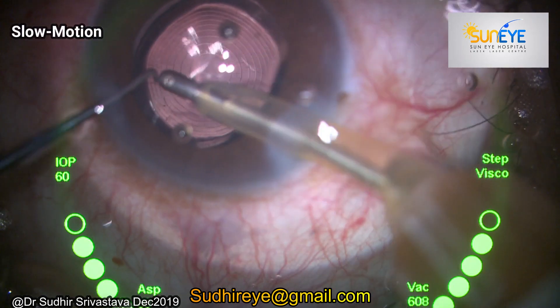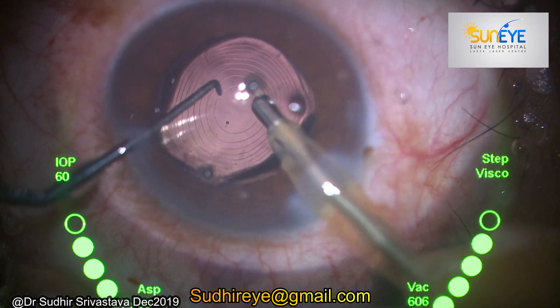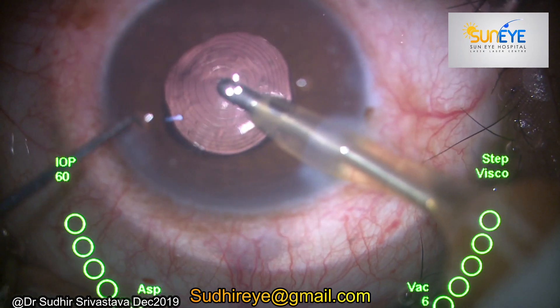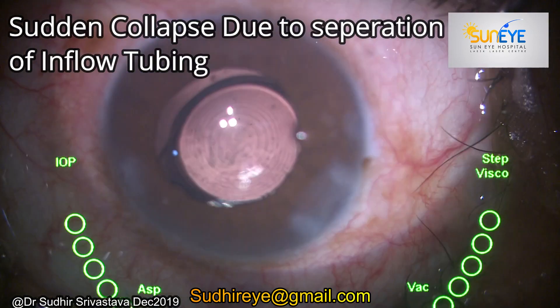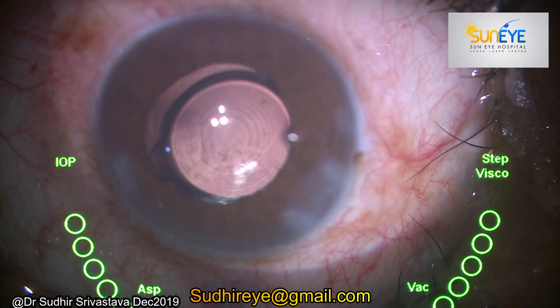See this in slow motion — I was working on nearly 600 mmHg vacuum and there was a sudden decompression of the anterior chamber. I stopped the surgery. It happened because of sudden separation of the inflow tube from the IA handpiece, so because of no influx of fluid into the anterior chamber, the chamber collapsed.